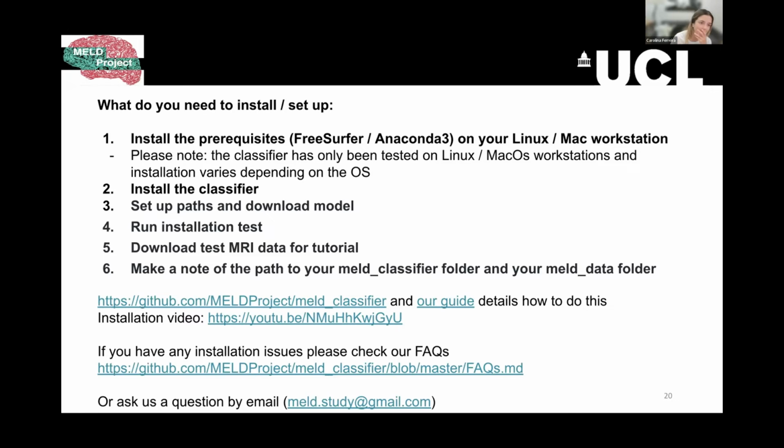Right. I forgot in the FreeSurfer folder, the first thing is the version. Yeah, exactly. I would just be careful because I'm dealing with that, and it's always very easy to forget. Once FreeSurfer is activated in the bashrc, it's really easy to forget to change the version when you're changing studies, for example.